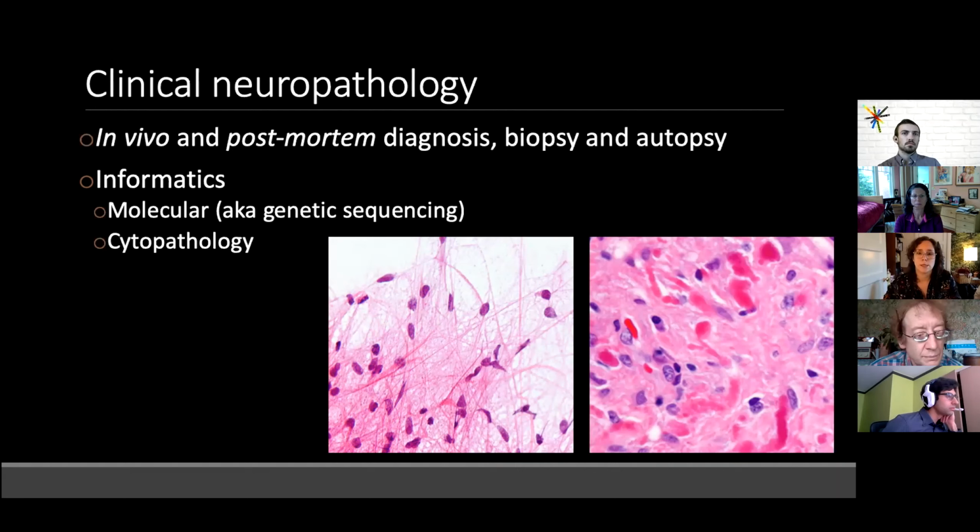the same disease. And it's important to point out too that although samples might be sectioned from whole tissue, as in this example on the right, they may not be able to be obtained until after a major surgery or even post-mortem, which of course makes it of limited utility as far as treatment of the patient. So currently, cytopathological analysis often is a bottleneck for neuropathologists, and many institutions employ people referred to as cytotechnologists, and these people help with the workload by flagging samples that are most likely pathogenic for review by clinicians.